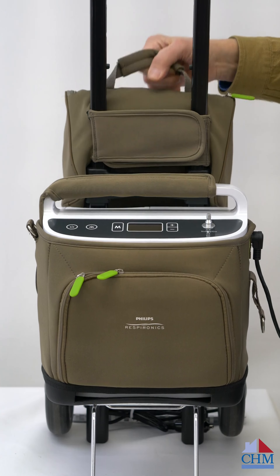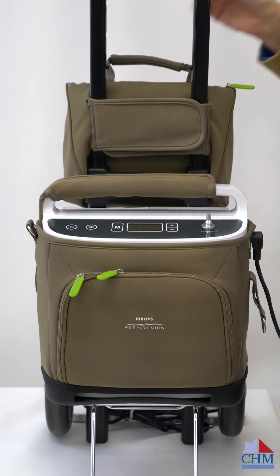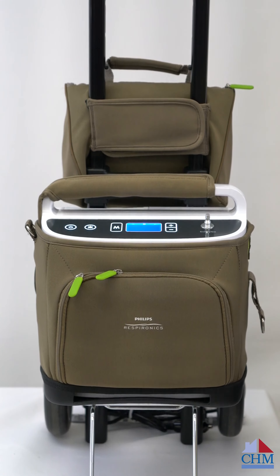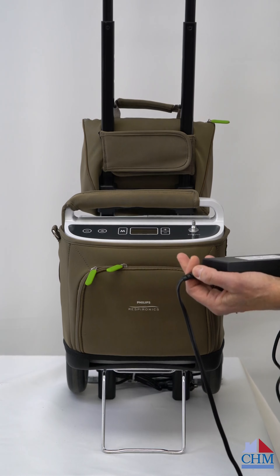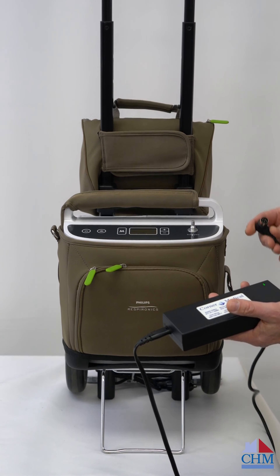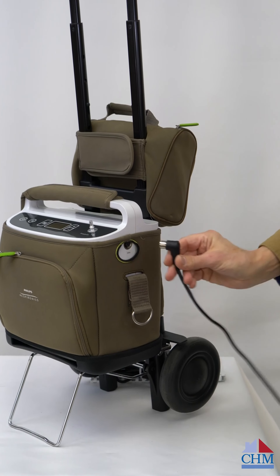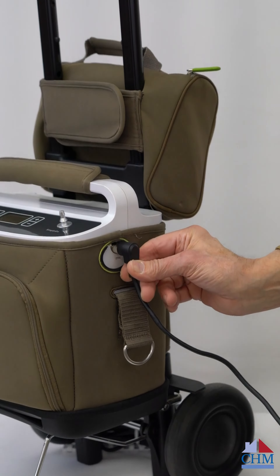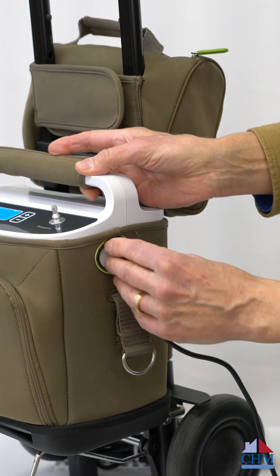This unit has an accessory bag on the back, as all the units do — that's normal for all of our POCs. In the accessory bag there's a charger, which is an inverter that plugs into the wall. We've got AC coming in one end and 12-volt DC coming out the other side. The charger plugs into the side of the unit and is configured with pins so it's easy to insert — it only goes in one way.